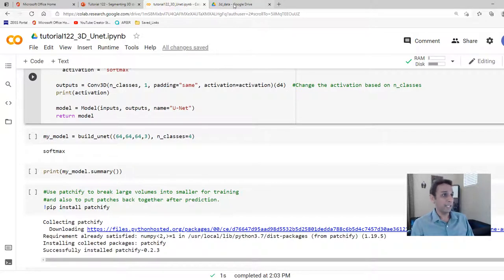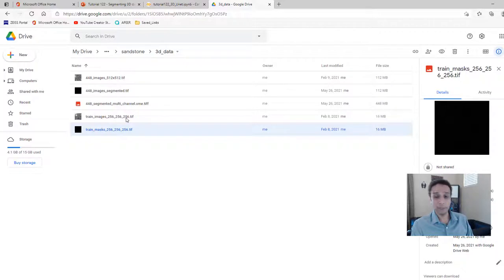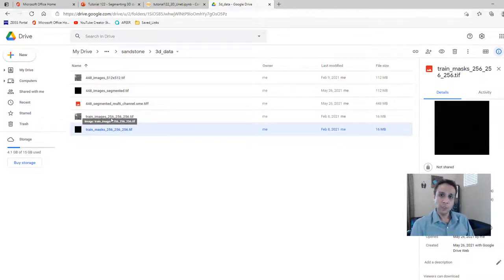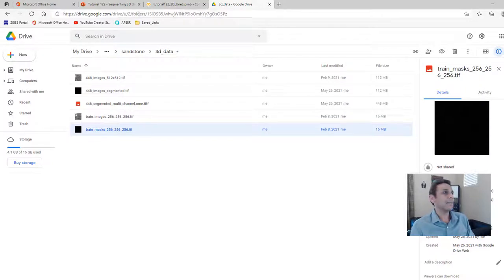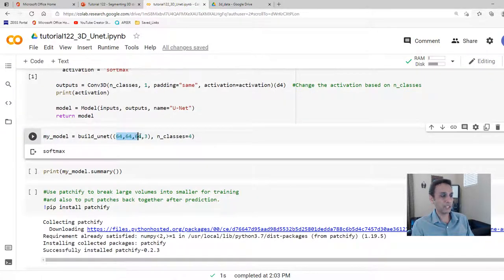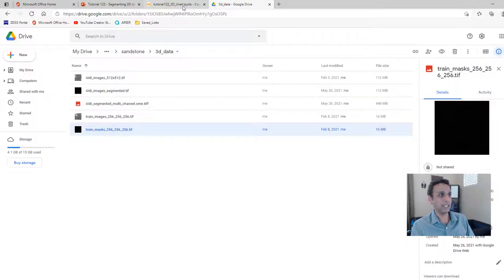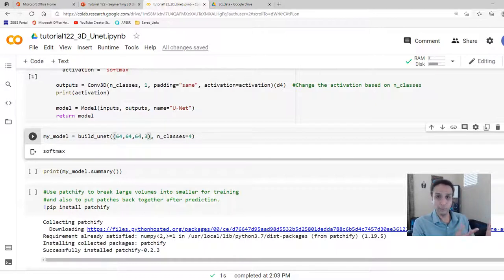My input images are 256×256×256 — I can't load all of that into memory at once, so I'm dividing into patches of 64×64×64. I divide the large volume into smaller volumes of 64×64×64, train the model on one, load the next, and so on. I'm building a U-Net with input size 64×64×64 and 3 channels — loading as color channels — so that those working with RGB volumes know how to handle this.